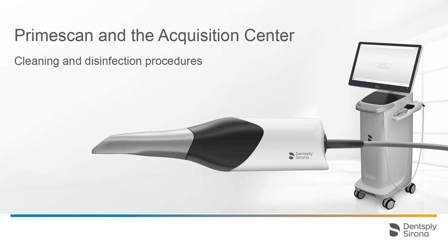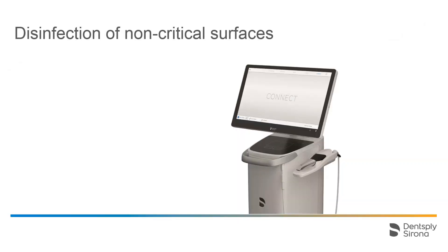Welcome to this video tutorial. This video provides an overview of the different cleaning and disinfection procedures for the Acquisition Center with PrimeScan. During the development of the Acquisition Center and the PrimeScan, we paid a lot of attention to creating smooth surfaces and almost seamless transitions, particularly in regards to cleaning and disinfection procedures. To avoid possible infection of patients, as well as practice staff, certain procedures should be applied.